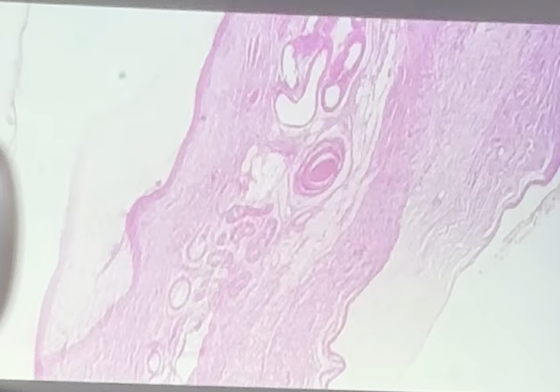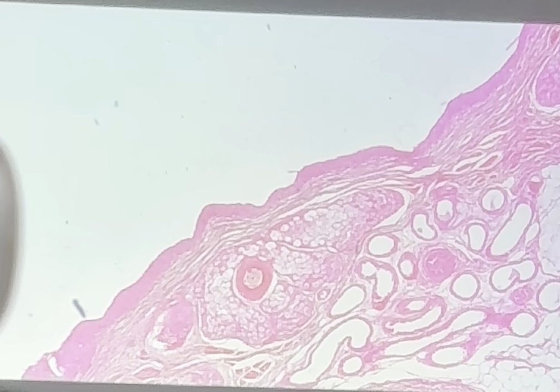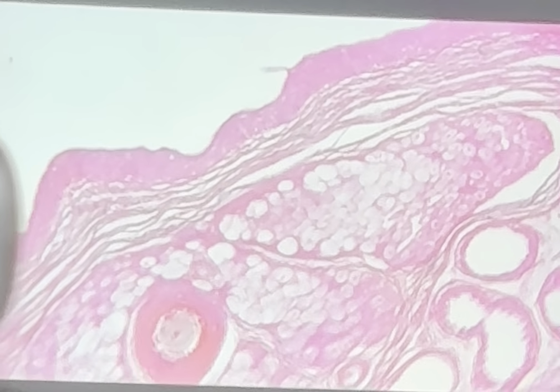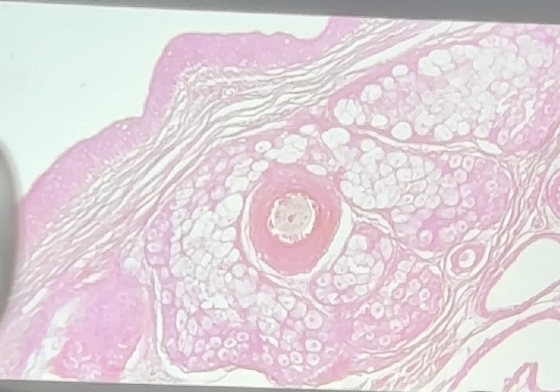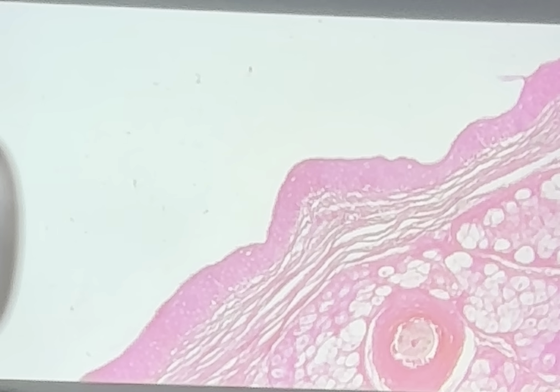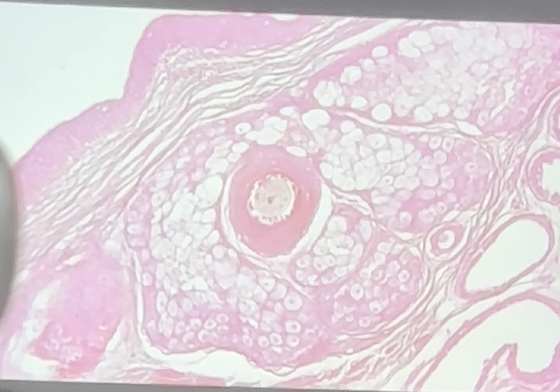let me tell you where this specimen came from before you give the diagnosis. So this specimen is from an ovary. So what's the lining epithelium that you see? Although I know the staining is quite bad. It's here, the lining epithelium, stratified squamous. Is that normal for an ovary? No. What's this structure in the center, the circular thing?